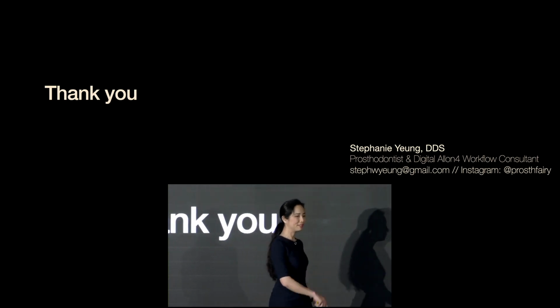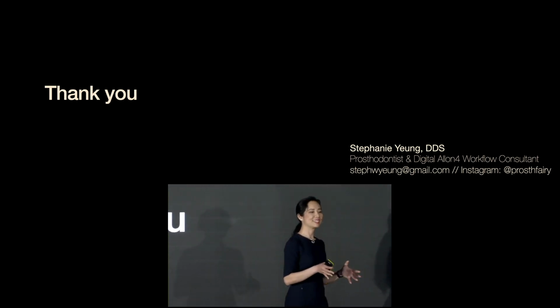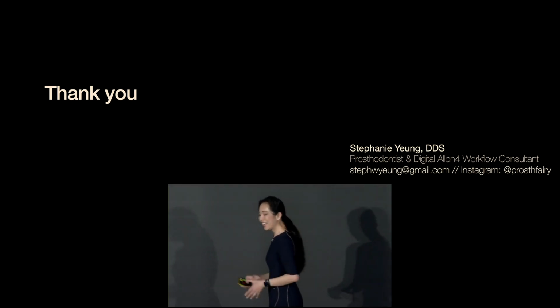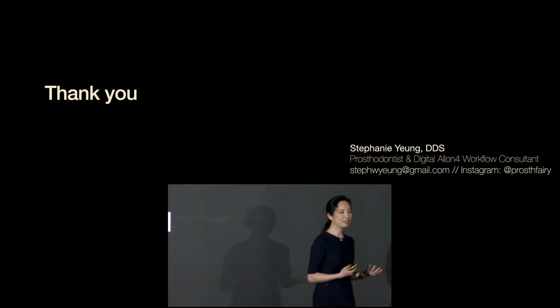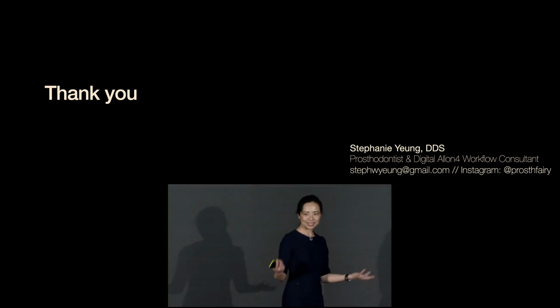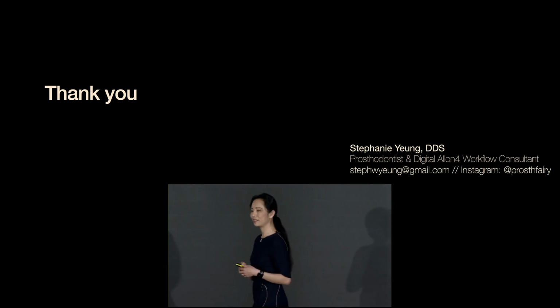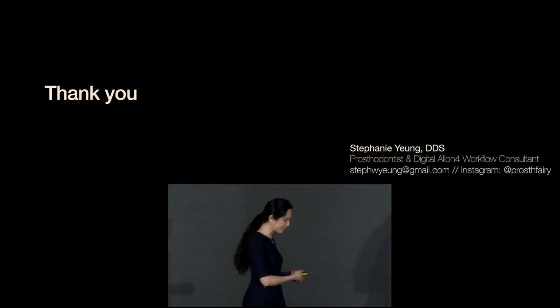So thank you for joining me through this series. I tried to make this more succinct because I figured everyone wouldn't want to hear me for a solid hour and a half. So if you have any questions that are specific to this system, please go ahead and ask. That's why I also wanted to leave extra time for it, because this one is actually more curious for most people than iCam at this point.